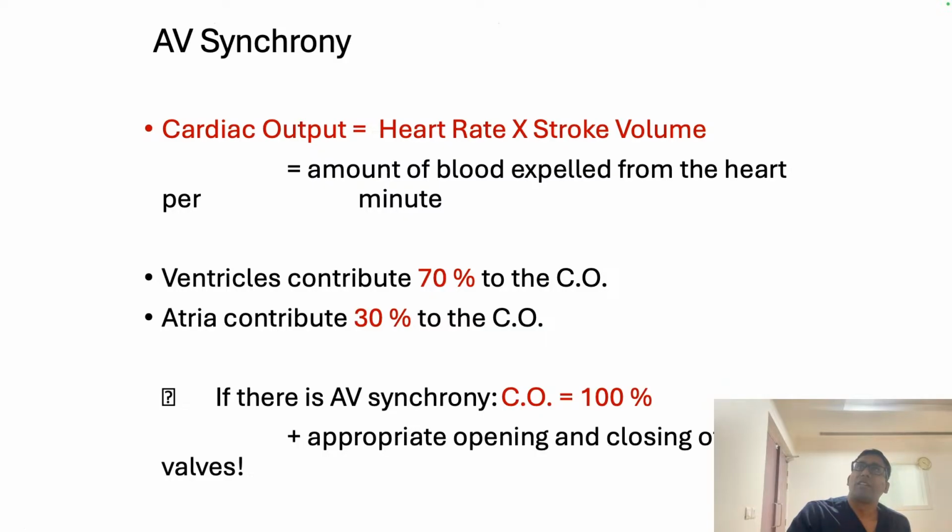So there is one condition. I think it is better to discuss it whenever we are putting in a single chamber pacemaker. AV synchrony will always be compromised, because when the atrium is contracting and the ventricle is contracting, part of the cardiac output will regurgitate. TR, MR can develop, so dyssynchrony also develops over time. It has been seen that some patients start developing heart failure, and pedal edema will start happening.